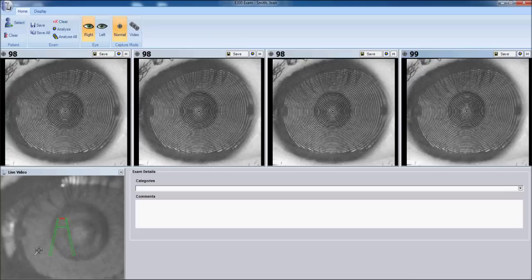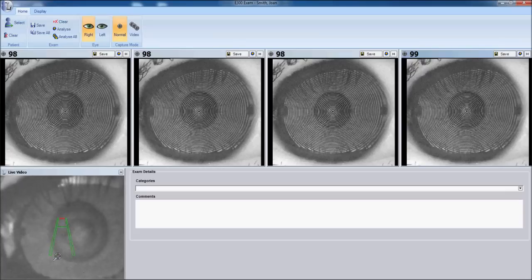This concludes the section on capturing with your Medmont E300 corneal topographer.